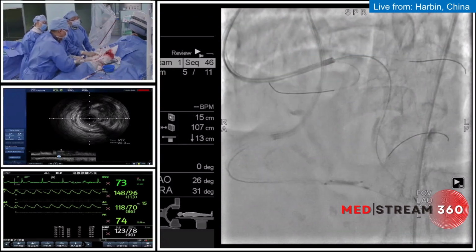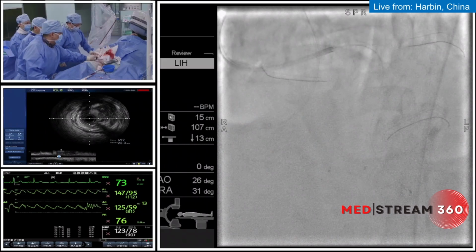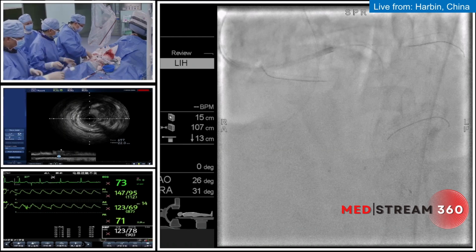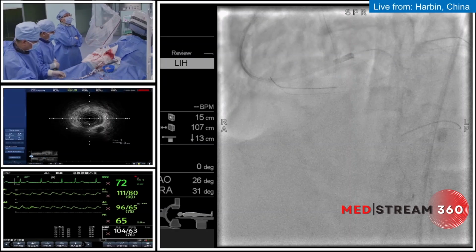So from the bilateral angiography, we can see another, the third, small branch giving out from the POC area. However, I think it's relatively small, and we can see after kissing balloon whether we take the risk of losing it. Certainly, I think we need the jailed balloon technique.